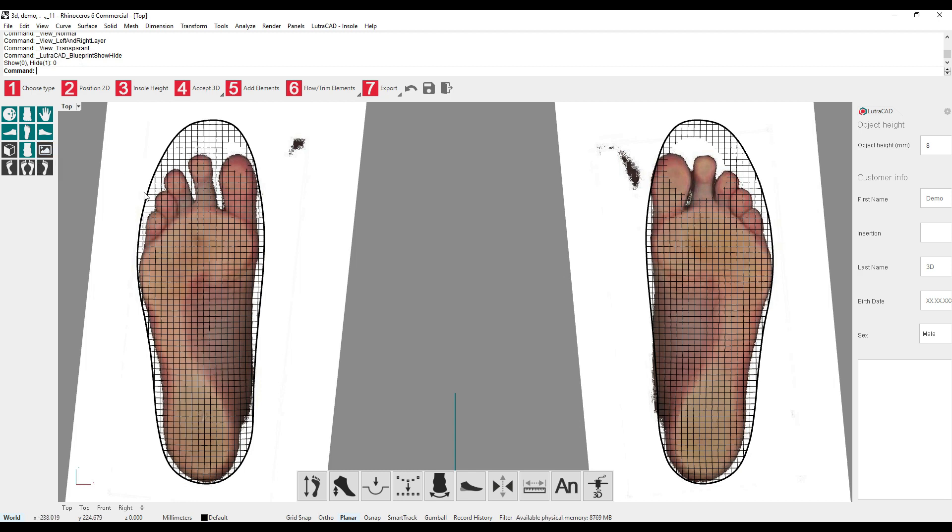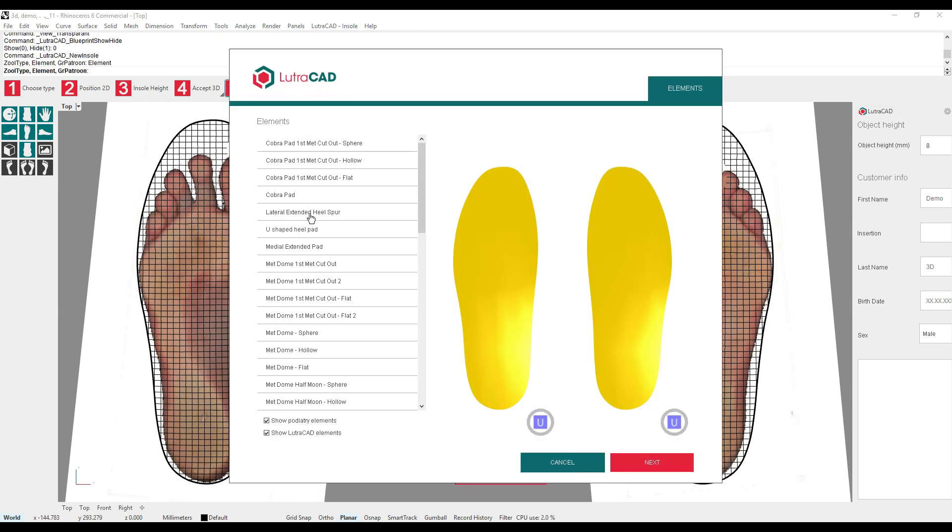For example, if we add a metatarsal pad, we can check if it is on the right place.